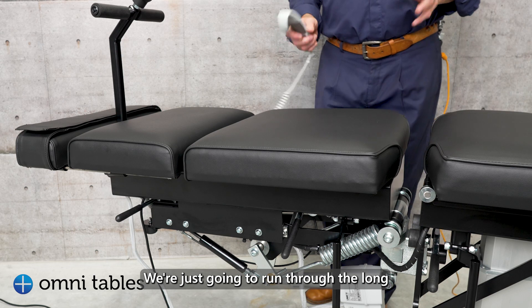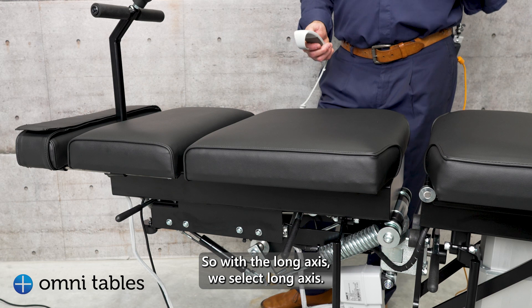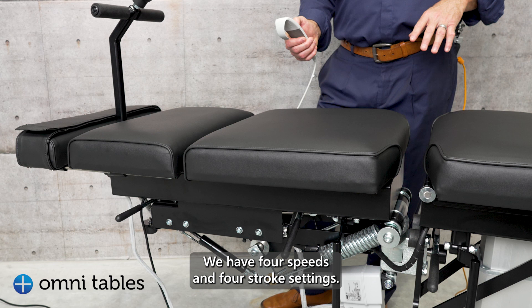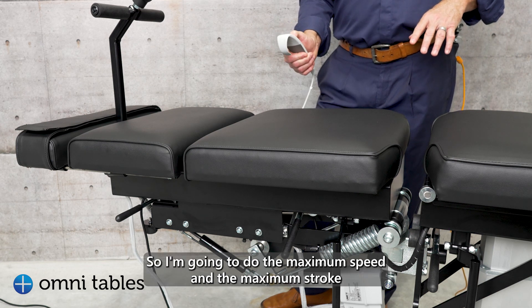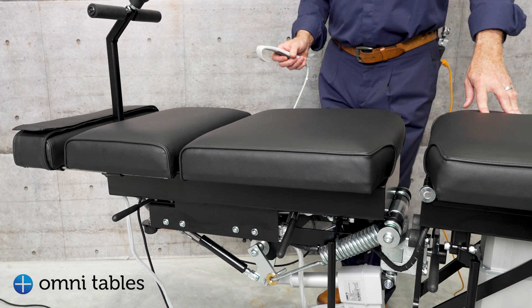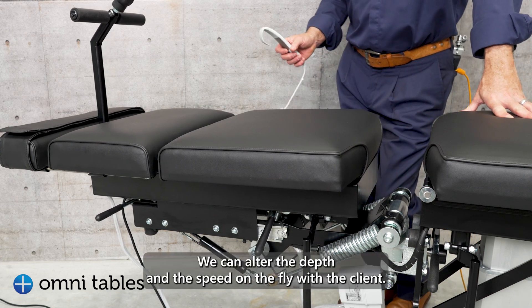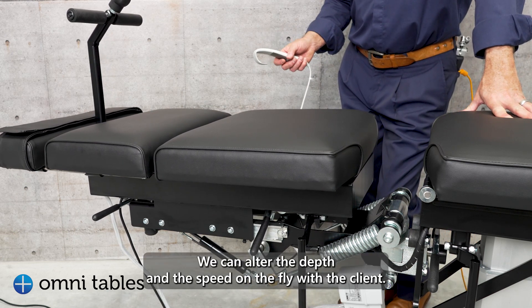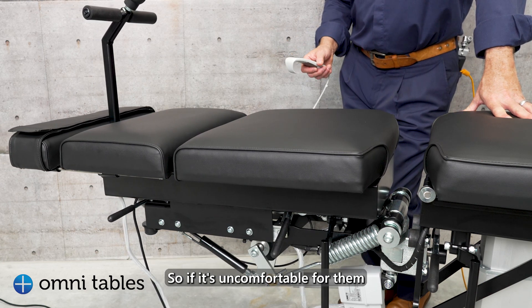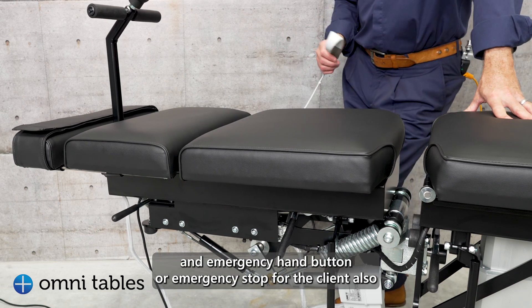We're going to run through the long axis distraction on our Total Drop Flexion Distraction table. With the long axis we select long axis — we have four speeds and four stroke settings. I'm going to do the maximum speed and the maximum stroke and we're going to run. Just the same as the flexion distraction, we can alter the depth and the speed on the fly with a client, so if it's uncomfortable for them. Remember, there's an emergency stop for the practitioner on the handset, and a separate emergency stop button for the client also.